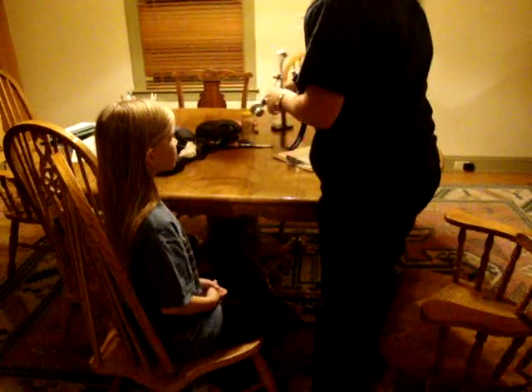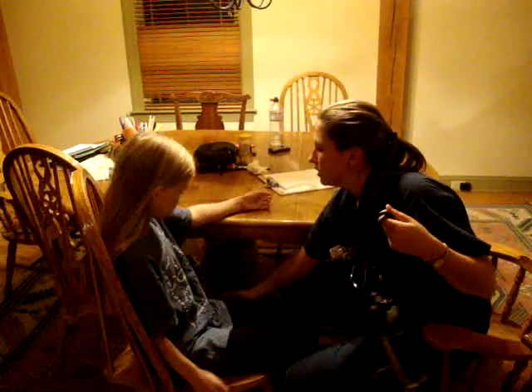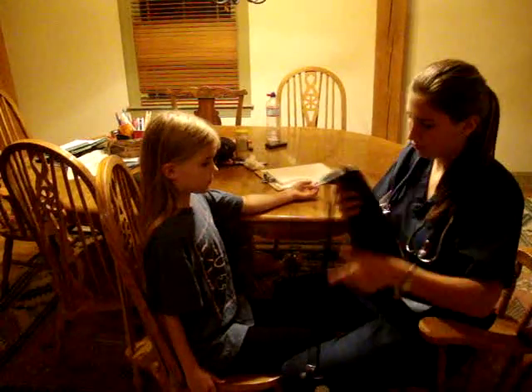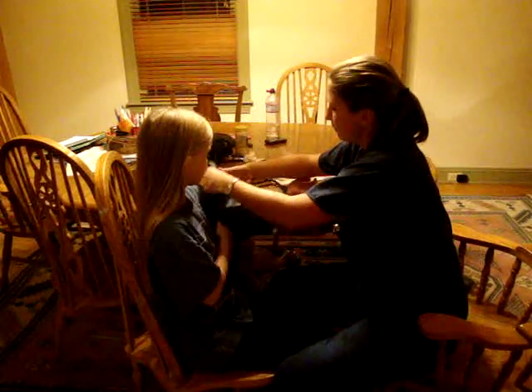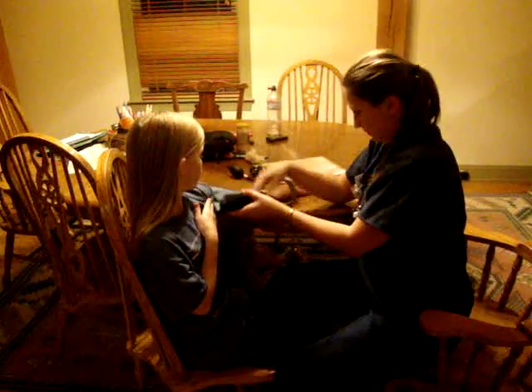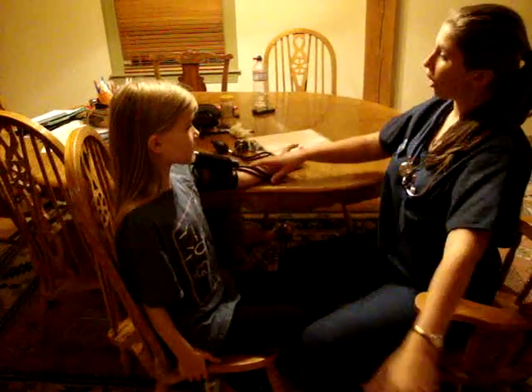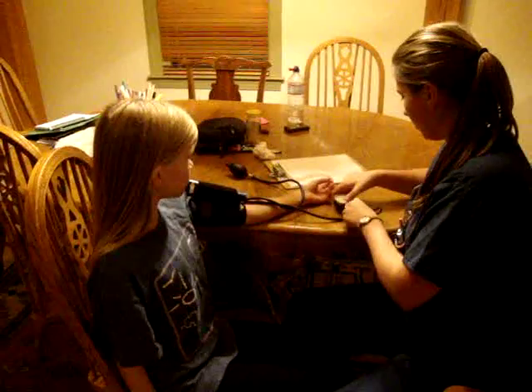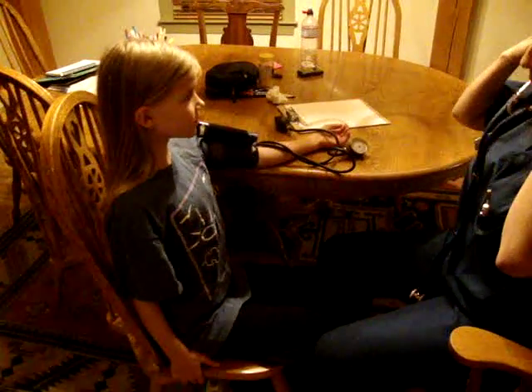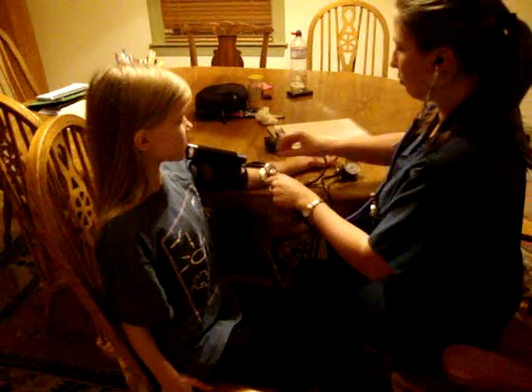Now I'm going to take your blood pressure. Move your arm and put it this way. Put about two fingers up — there, that's good. I'll probably use a little bit smaller blood pressure cuff for you because you are a little bit tiny. It's supposed to be 80% around the arm, and it's supposed to be tight enough that if you put your arm down it doesn't fall down. You have to have your legs uncrossed, sitting up straight, and your arm at heart level. Now I'm going to pump it up until I can't hear your pulse anymore, and then I'm going to pump it 30 more.